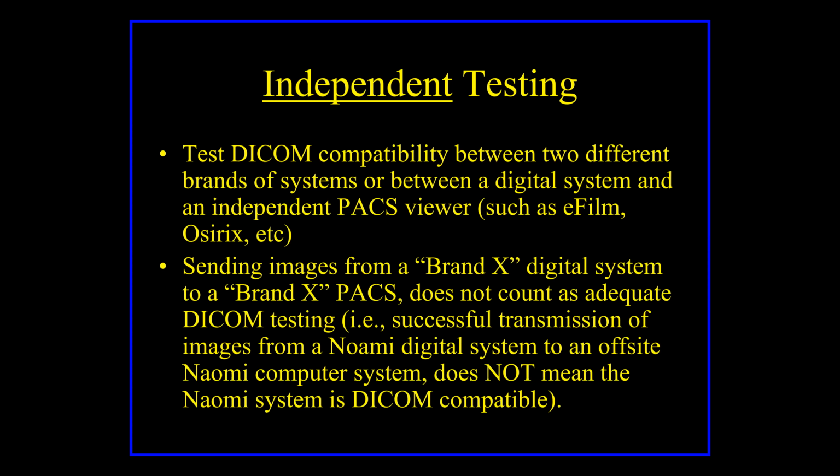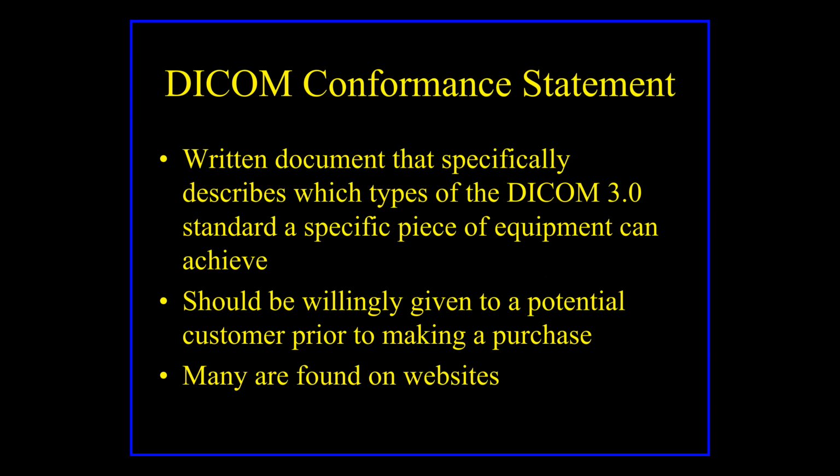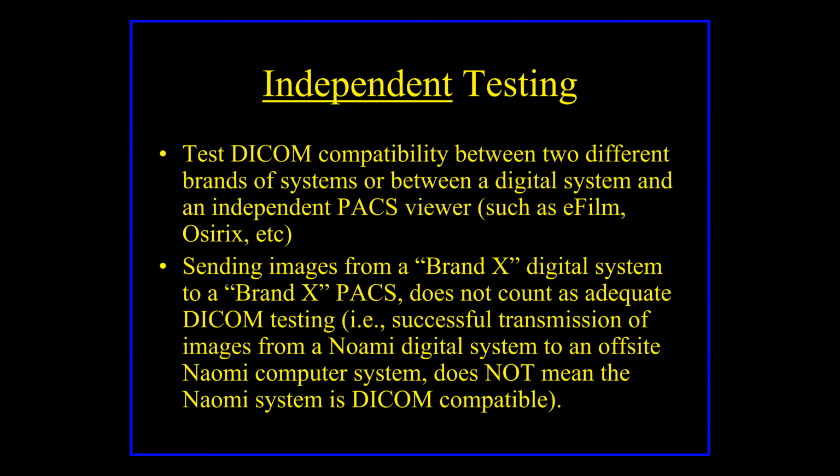So the thing about DICOM testing is you want to make sure that it's independent, okay? For instance, if I had an x-ray machine from IDEXX, and it's an IDEXX machine, and you say, well, is this DICOM compatible? And they say, sure it is. I can send my images. I'll show you right now. We have a customer on the West Coast in California, and I'm going to send my images from Maine.